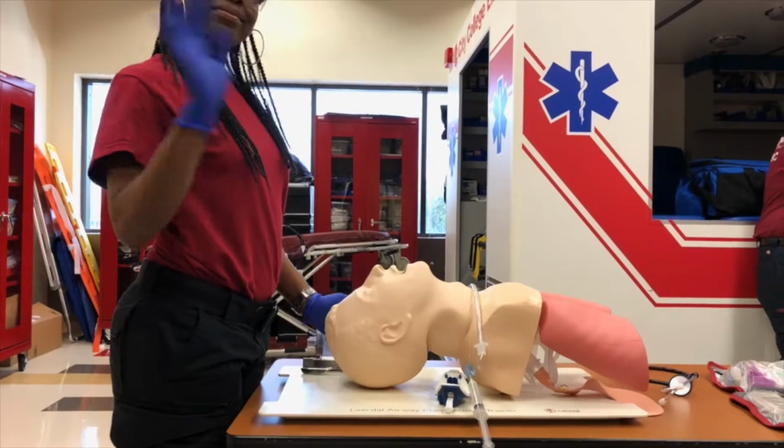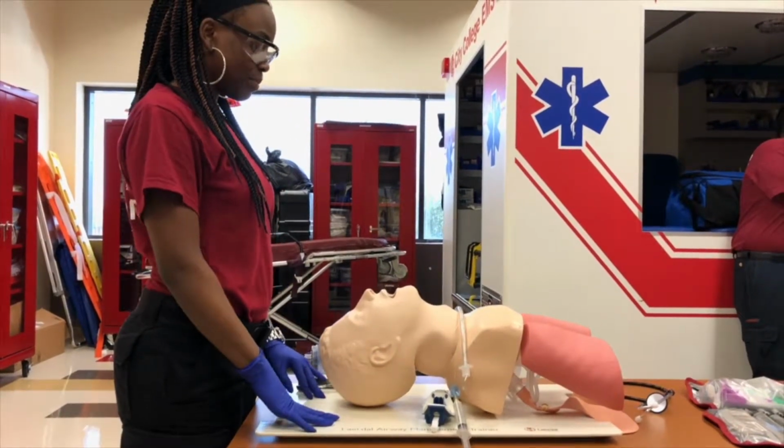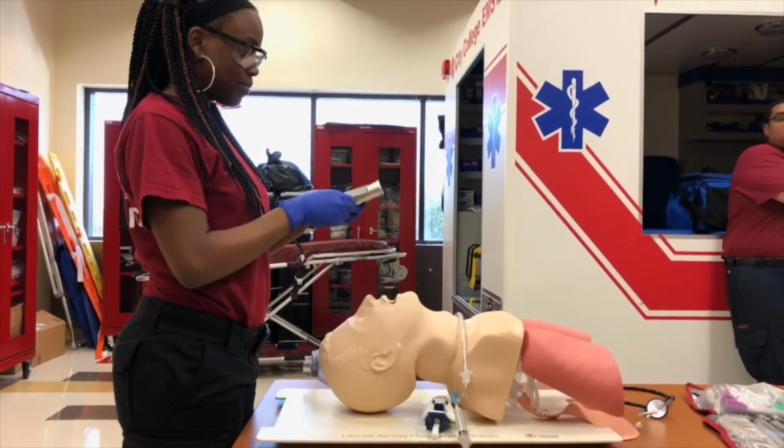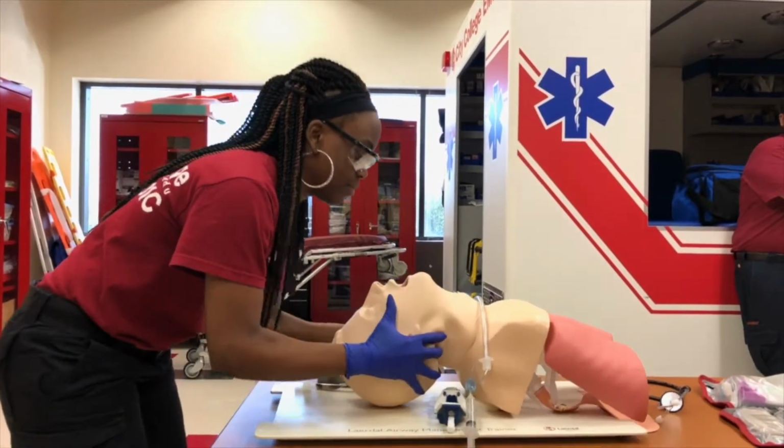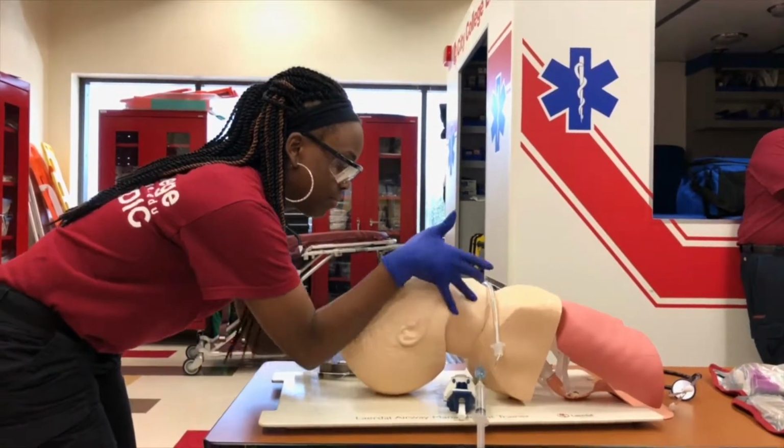This is Lenita from the EMS program, and she will be performing an orotracheal intubation. So the first step is to perform a head tilt chin lift to expose the vocal cords.